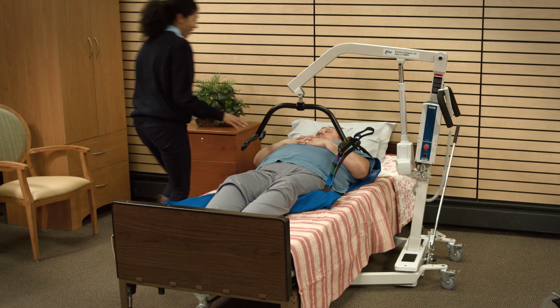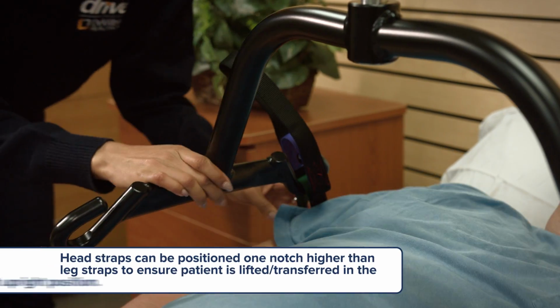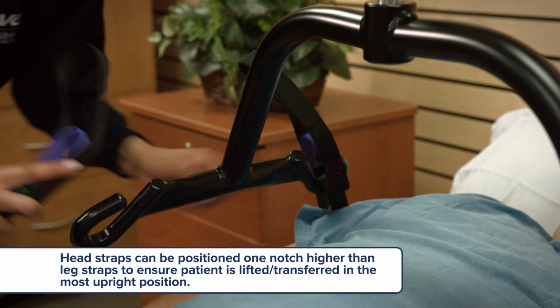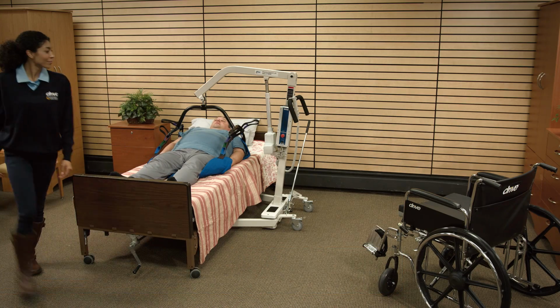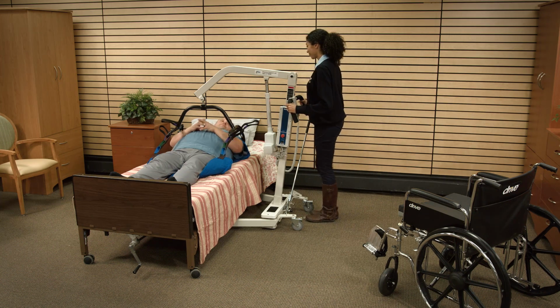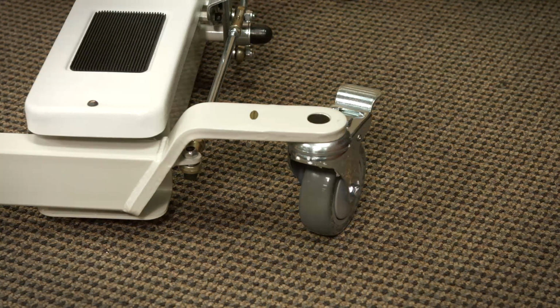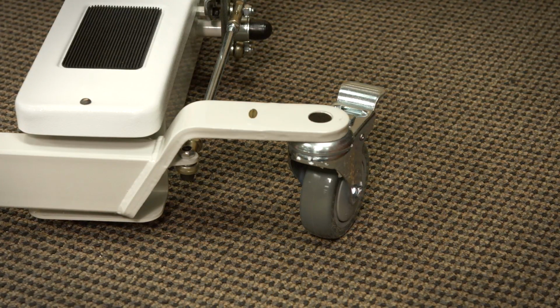Next, you will need to use the hanging straps. Hook those straps on the hanging bar. If a chain is used, make sure the S-hooks are away from the patient. Do not lock the casters of the patient lift when lifting an individual. Casters must be left unlocked to allow the patient lift to stabilize during lifting procedures.